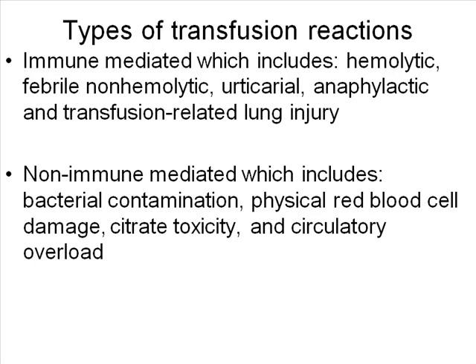Deteriorating red cells, even the little bit of plasma that's left in there when you pull the bag out, should be relatively clear. If it's not, I'd set that unit aside and pick up another one and go back to it if you're busy. Even clots, sometimes they don't mix the unit correctly, and you can have big clots forming.